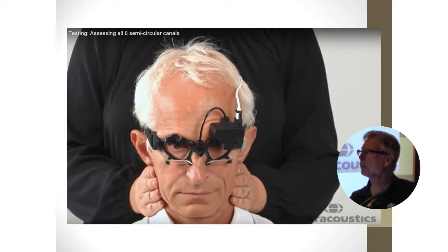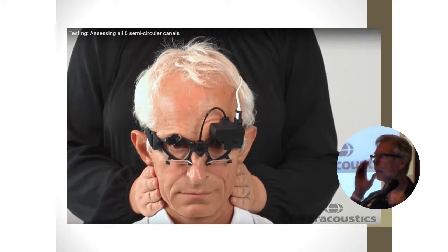And this is what requires technique. It's extremely technique-sensitive, and it takes a while. It takes some practice to get good at actually performing the proper impulse, which would be like this.